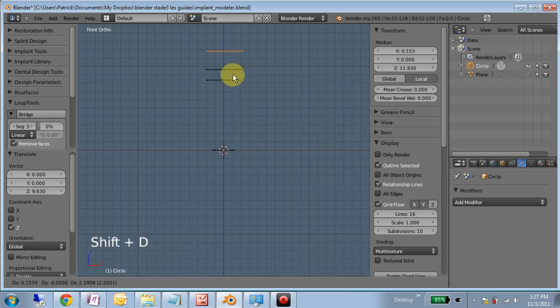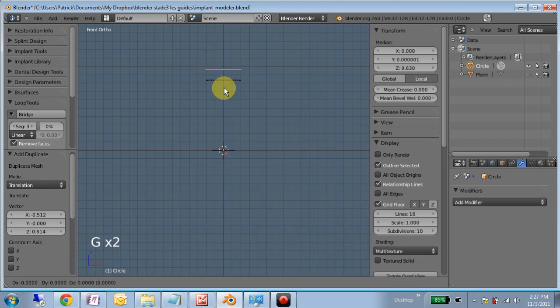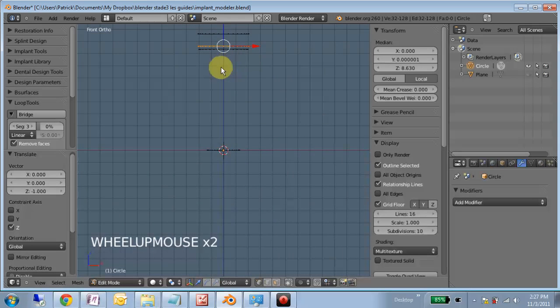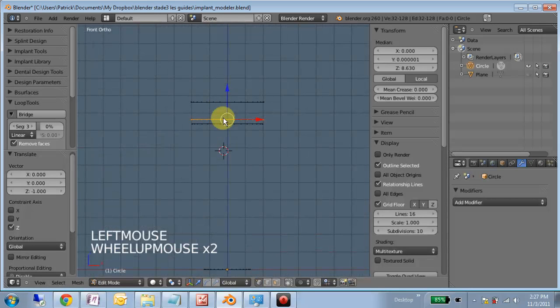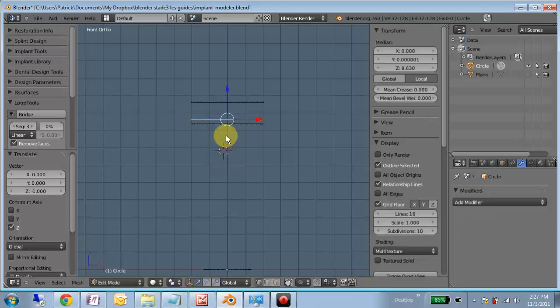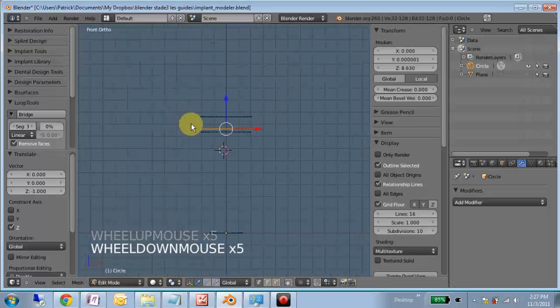Shift D to duplicate those. G, Z, minus 1. So when I bring these down 1 millimeter, I have established the 1 millimeter height of the collar, and I've come down a quarter millimeter and established the major diameter of the implant.